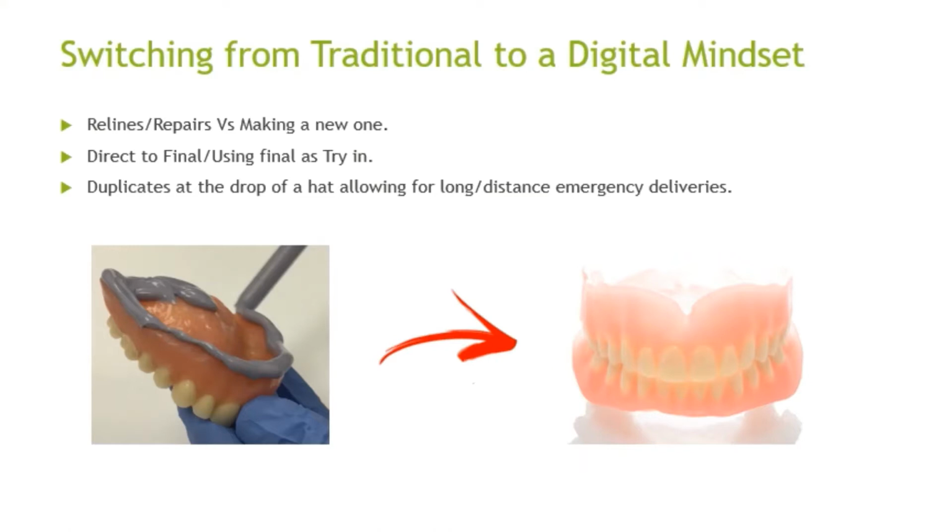And then, of course, duplicates can be done at the drop of a hat, so you can allow for long distance or emergency deliveries if patients are traveling, or if the doctor is out of office and for some reason you as a lab are requested by the doctor to send the dentures directly to the patient.